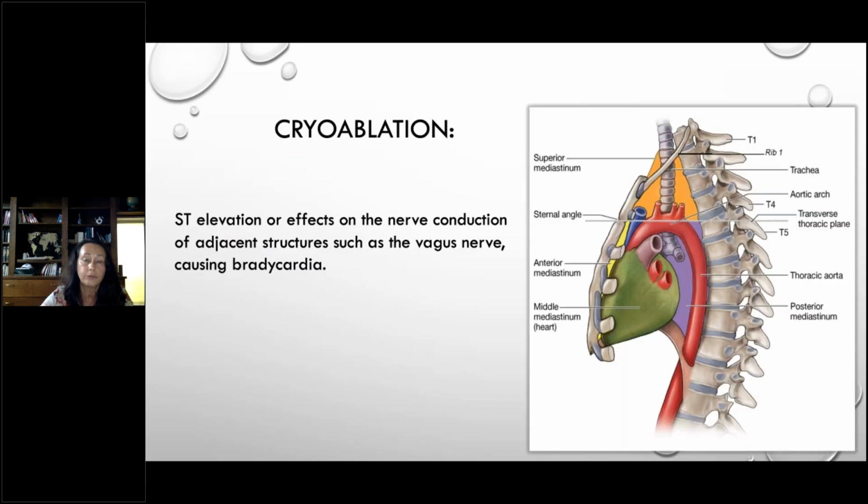I don't know how many of you are using cryoablation, because in our institution, the spray cryoablation with liquid nitrogen has been abandoned, to my delight. But even if we use topical cryoablation or topical laser, we should be aware of the structures behind the area we are treating thermally. If short bursts are used, there is really not much danger.